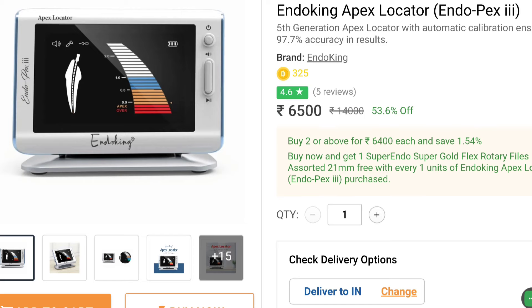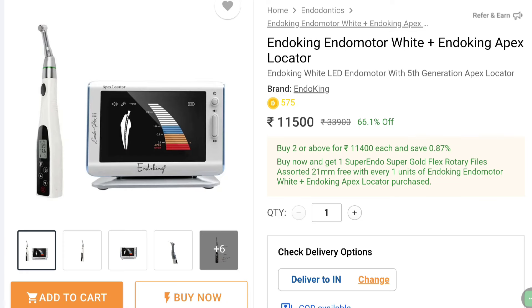There are many apex locator options available in the market, starting from a price range of six thousand five hundred up to sixty-five thousand rupees. Our recommendation is the Endocking apex locator, worth around six thousand five hundred rupees, if you are in search of only an apex locator. If you also need a new endomotor, our recommendation is a combo pack from Endocking providing both an apex locator and a separate endomotor at a cost of eleven thousand five hundred rupees.